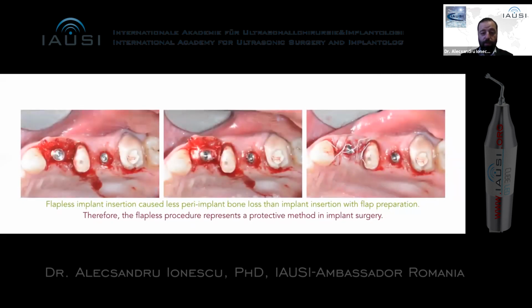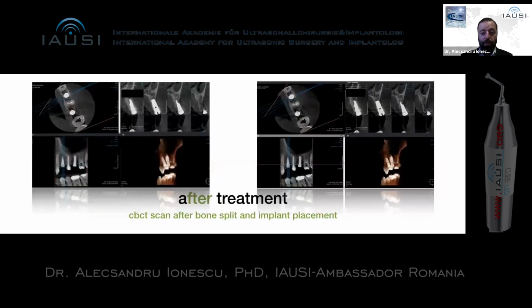And then we sutured, and you can see it's just a crestal incision, and we covered the gap with the Bio-Gide as usual, and we did not intend to close with tension. So it's like the open healing concept.